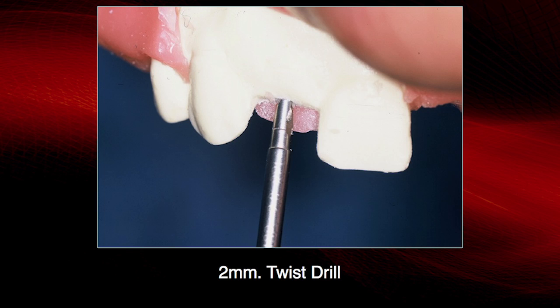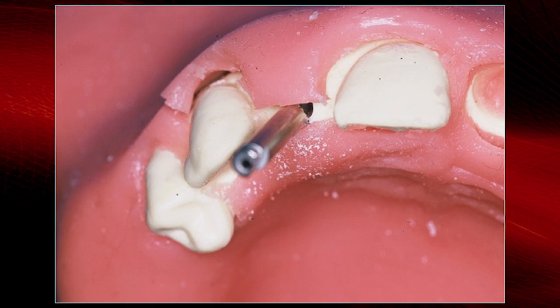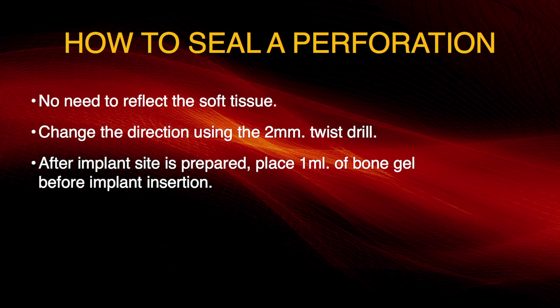So there you can see the 2mm twist drill is parallel to the adjacent teeth. So you can see the line. Generally, we'd like to keep this in line with the incisal edge of the adjacent teeth. So no need to reflect the soft tissue if you perforate it. So you want to change the direction of the twist drill. So if you perforate it into the subnasal fossa, you want to back out and redirect it to the palatal.